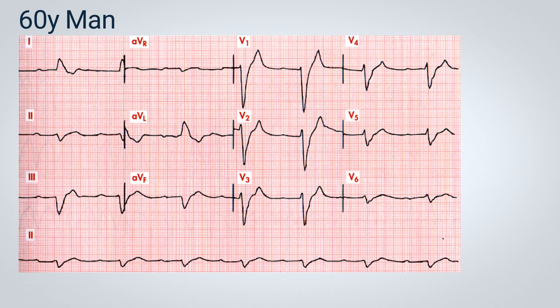The first electrocardiogram we will examine is displayed on the screen, featuring a 60-year-old male patient. I suggest pausing the video to carefully analyze the ECG before I begin discussing it in detail. Upon examining this particular ECG, we can clearly observe a significant widening of the PR interval accompanied by a sinus rhythm. Additionally, there is an extremely widened QRS complex that does not correspond to any specific conduction disturbance, such as left or right bundle branch block. This widened QRS complex is also associated with a sharply peaked T wave. These findings suggest a potential case of severe hyperkalemia.